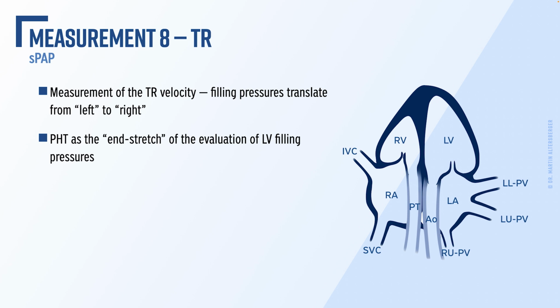In the previous videos of diastolic dysfunction, we already started discussing myocardial mechanics and some measurements. In the next couple of slides, I want to talk about the measurement of tricuspid regurgitation. That is a very important measurement.